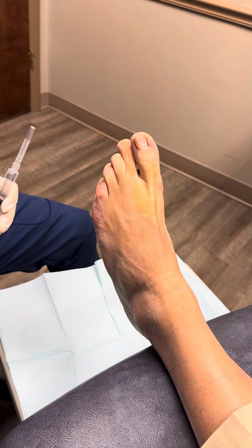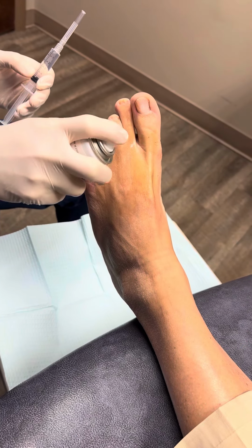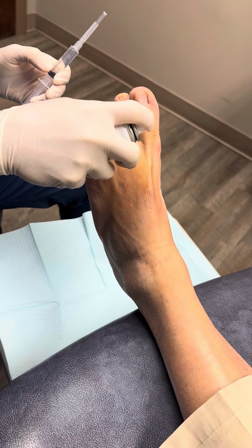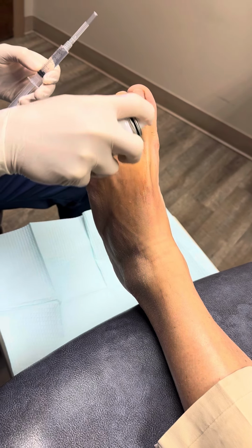So I'm going to take some ethyl chloride, and that's some cold spray. And what this does is it numbs up the skin. This is very cold, and we're going to just really, really numb up that skin. And we're going to tell him exactly what we're doing. So you should feel a lot of cold sensation on your toe here. And then we're going to get this nice and cold. Feeling that coldness? Oh, yeah.